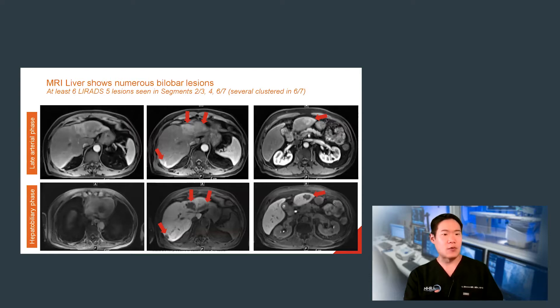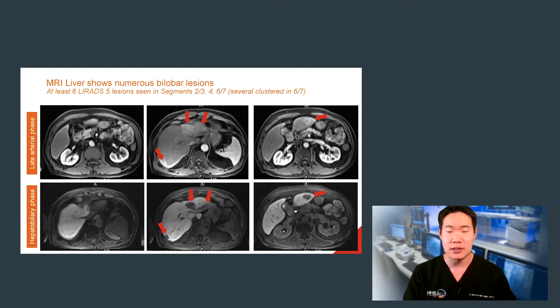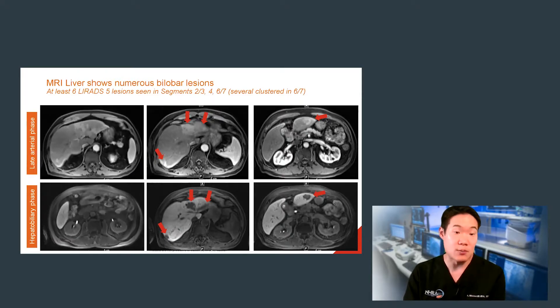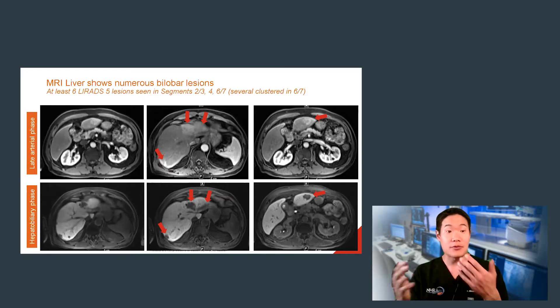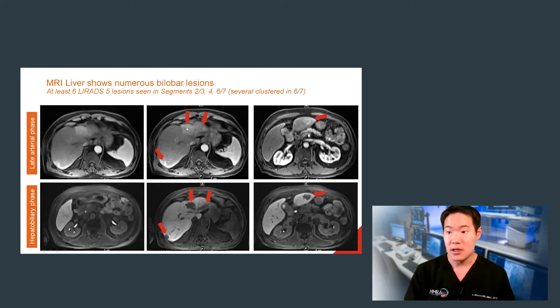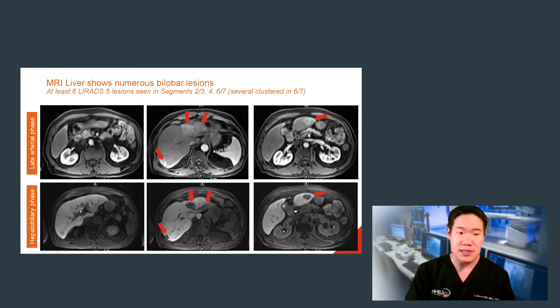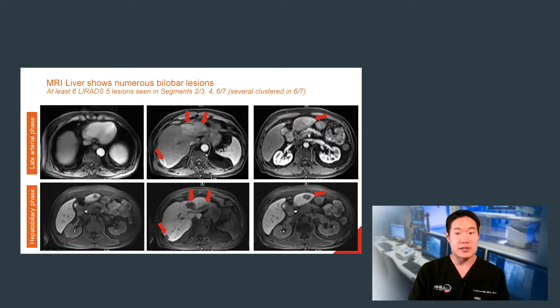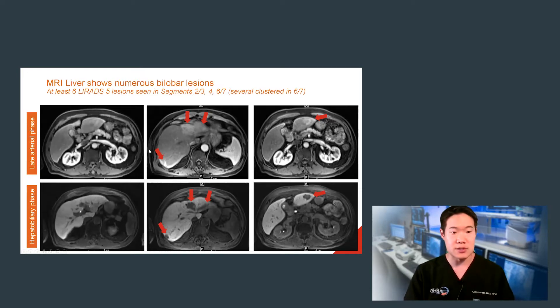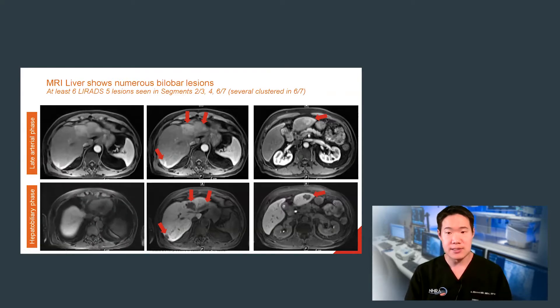His medical oncologist performed an EOVIST liver MRI, which triggered the referral to my clinic for local regional therapy. On reviewing the MRI, it became quite clear that there is a multiplicity of clustered lesions involving both hepatic lobes, several of which I've indicated here with red arrows, on both the late arterial phase as well as the hepatobiliary phase. All of these lesions demonstrated arterial enhancement with portal venous washout and persistent hypo-intensity on the hepatobiliary phase — so these are all, unfortunately, HCCs.